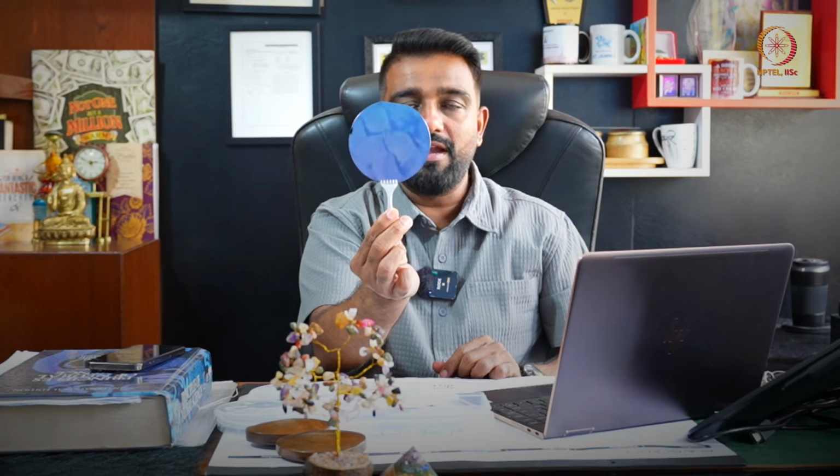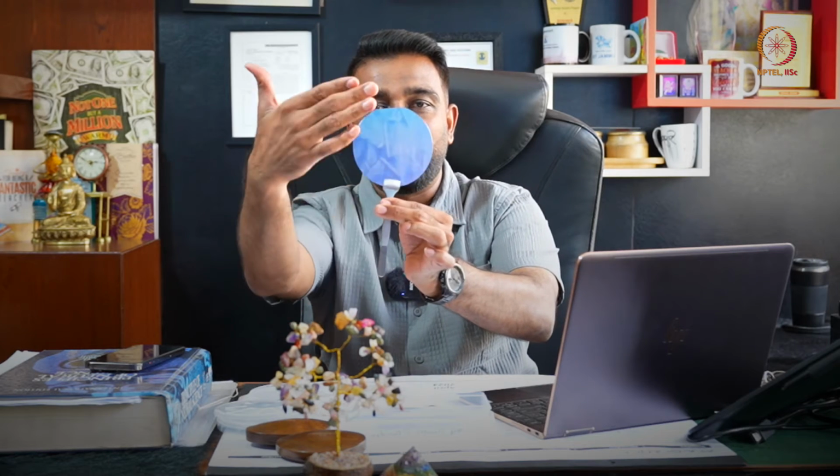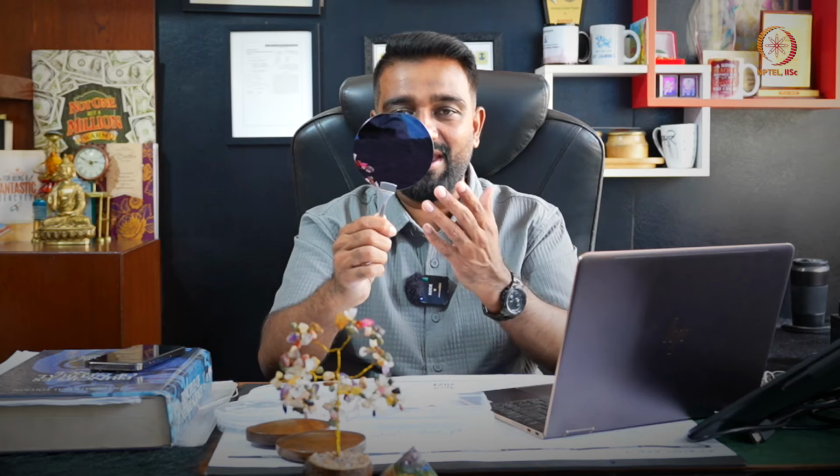So let me show you the wafer I talk about. The way I am showing is not the right way to show, but this is just for you to understand and see how a silicon wafer looks like. The wafer that I am holding right now in my hand is a 4-inch silicon wafer. It is a single side polished or double side polished. You can see some mirror image, and here also you can see the same thing. It is a double side polished 4-inch silicon wafer. Now, students who have an undergrad in electronics or instrumentation or physics, can they tell whether it is N type or P type, whether it is 110 or 100? You may or may not be able to understand. How you can identify different orientations of wafers is also part of this course.